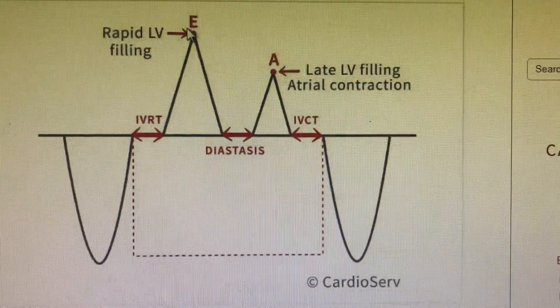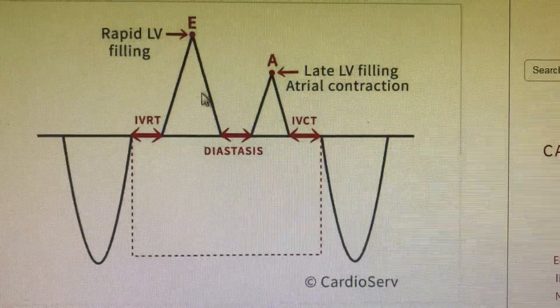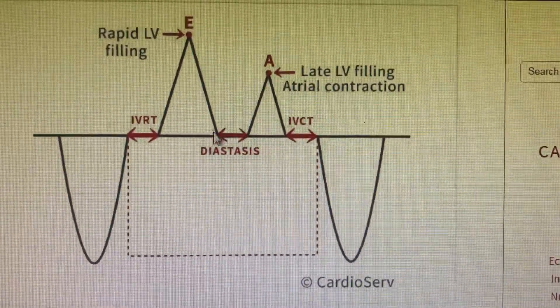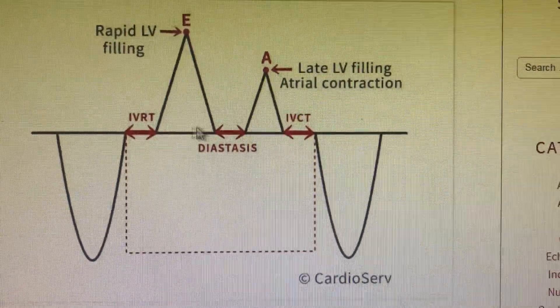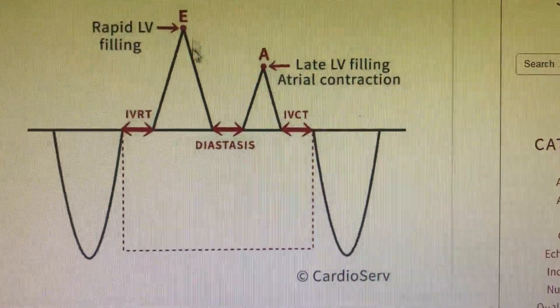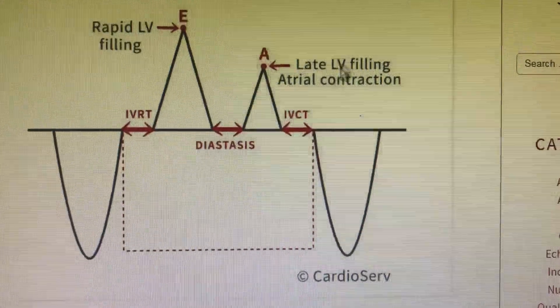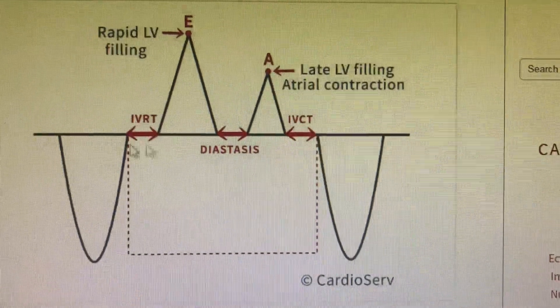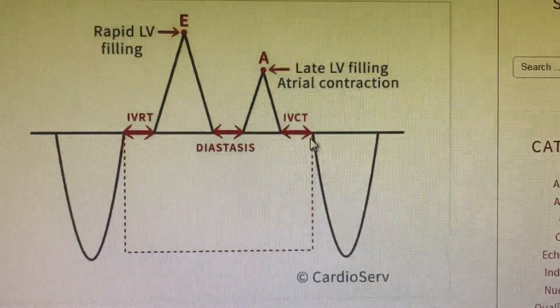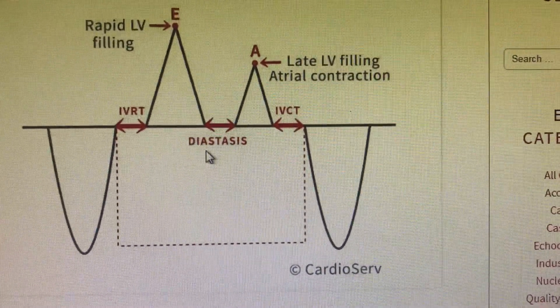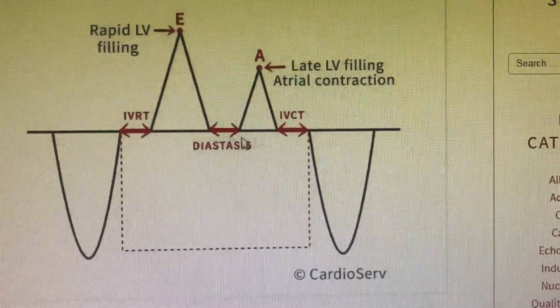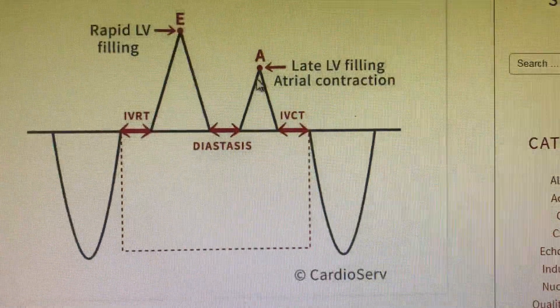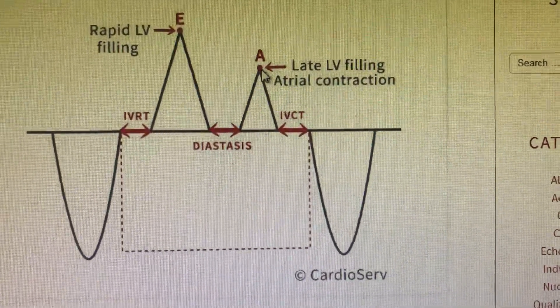After early rapid LV filling, deceleration occurs, then comes diastasis. Diastasis being longer is better. Many parameters like IVRT, deceleration time, E, and A amplitude may all vary with heart rate. If diastasis is prolonged, all may be prolonged. If diastasis is very much shortened — as in severe tachycardia or pericardial disease — all these components may become very narrow.